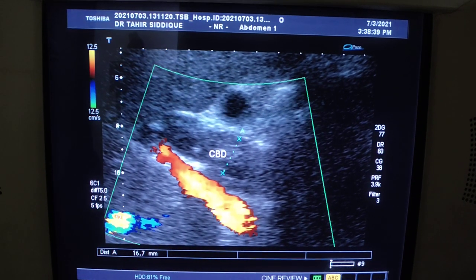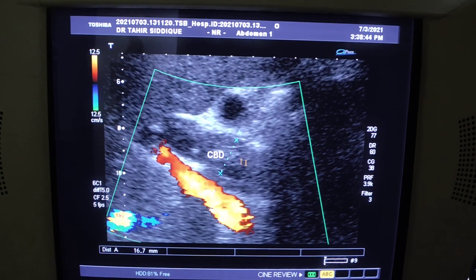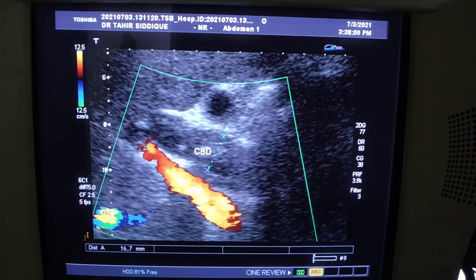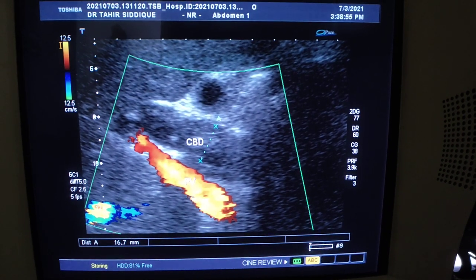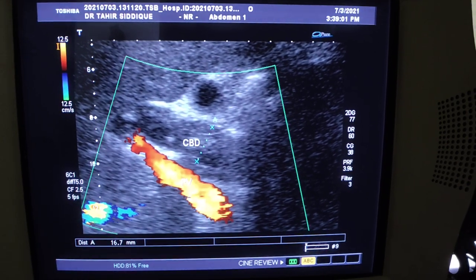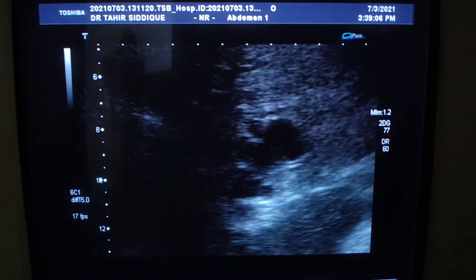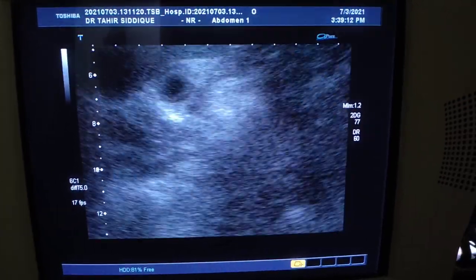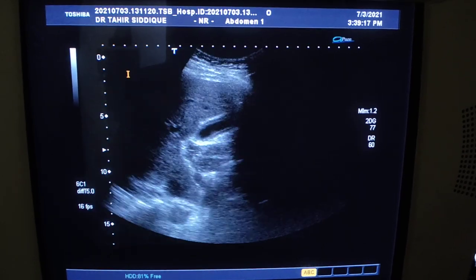This is the portal vein and this is the common bile duct. Here you see the transverse view — the gallbladder is normal. This is the IVC, this is the liver. Here we see a dilated CBD. At the distal end of the CBD — now showing the gallbladder — it is normal, with no pathology seen relating to the gallbladder.